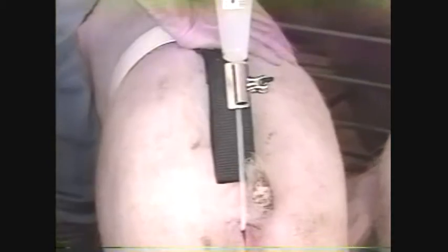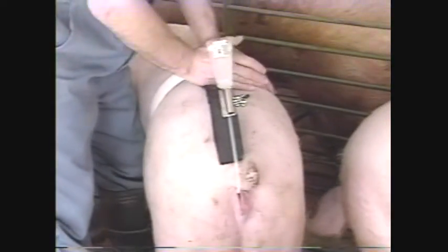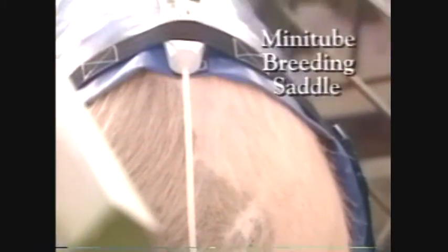Throughout the insemination process, continue to stimulate the sow by applying back pressure and by rubbing the flanks and underline. Back pressure may also be applied by the use of a saddle or breeding belt, which can be left on the animal for approximately 5 minutes following the AI in order to provide added stimulation.